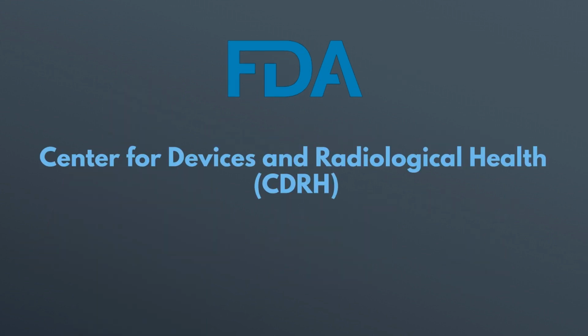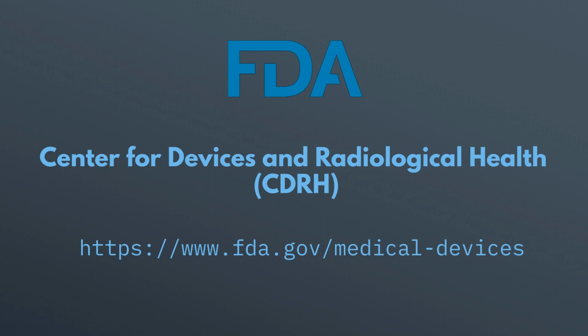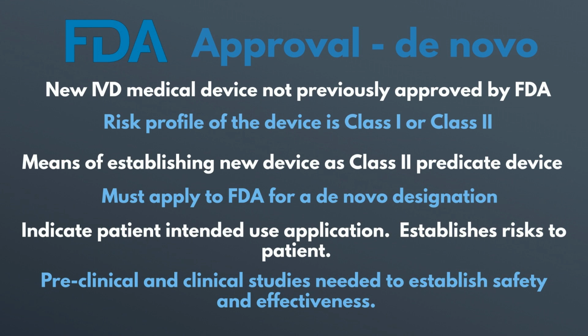How do you know whether your SaMD is a Class 2 device? Well, FDA has a database of all of the Class 2 devices that have been approved, and you can search that database and find products that are comparable to the SaMD that you're developing and demonstrate that this is a Class 2 device.